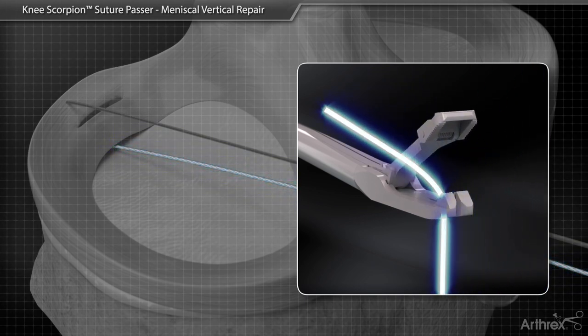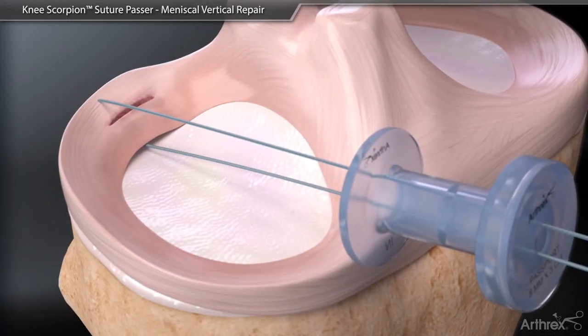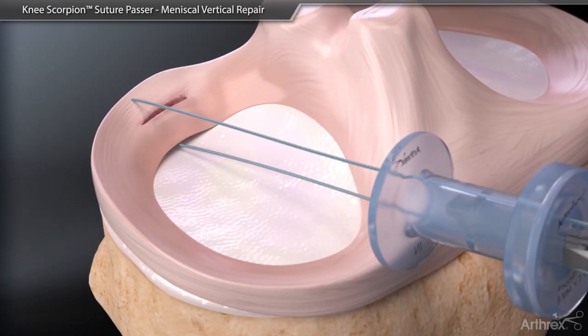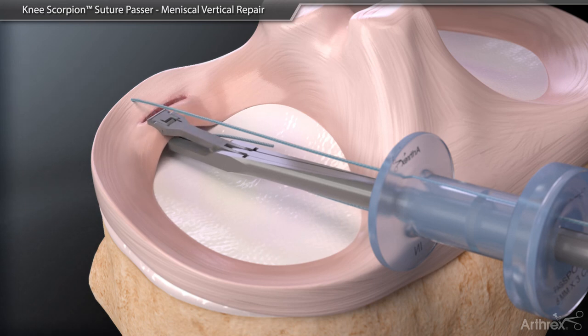Load the bottom jaw of the Knee Scorpion with the opposite end of the suture. Pass the loaded suture through the tissue anterior to the tear.